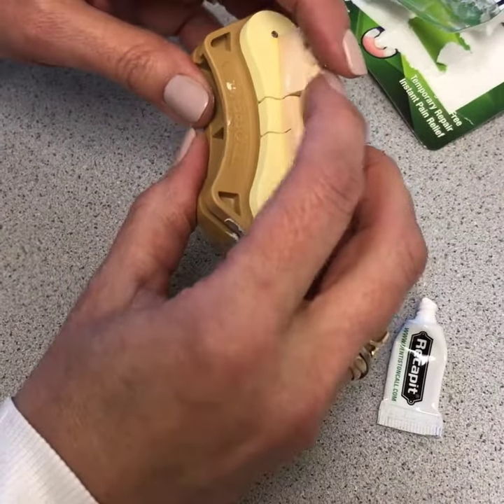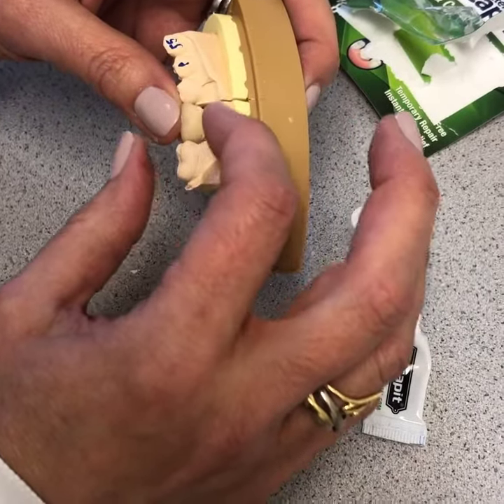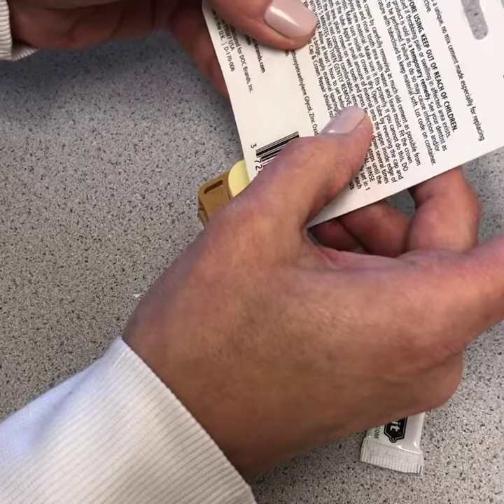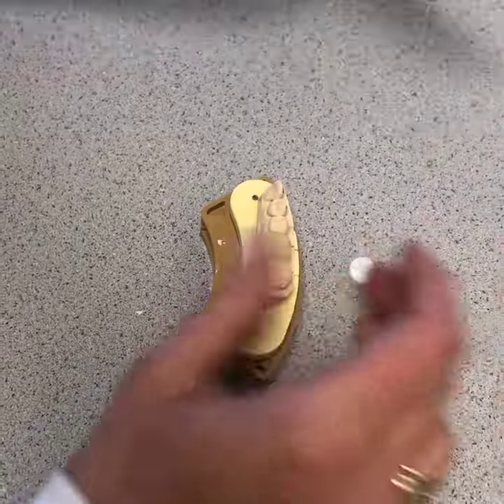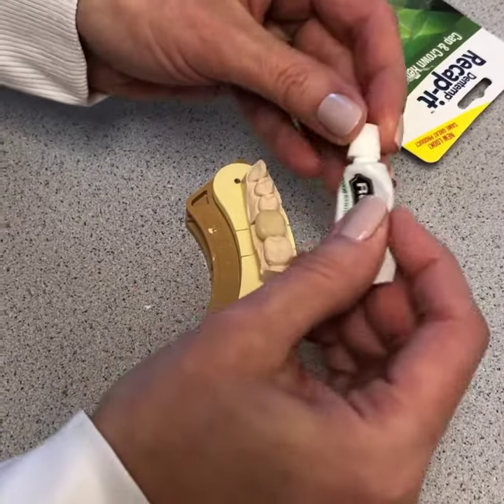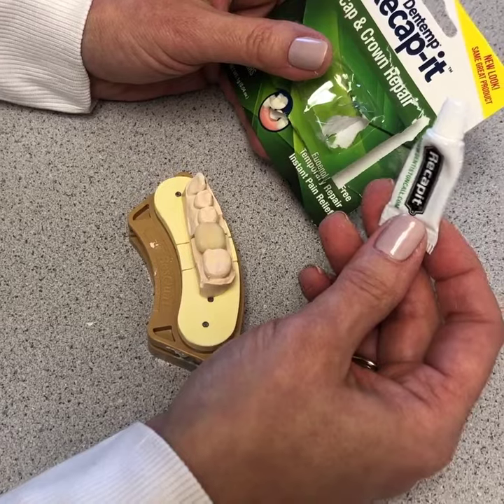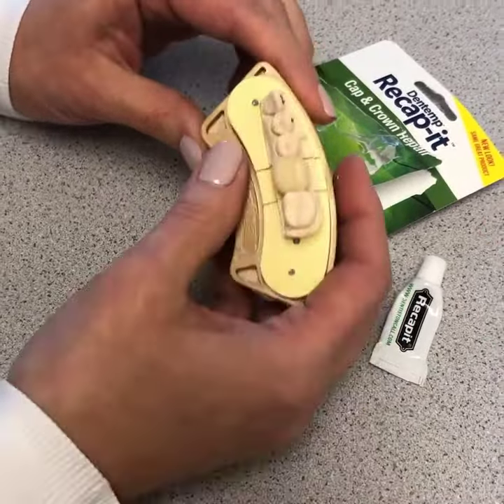Go ahead and place it on the tooth and squeeze it down. If anything comes out, just bite down on a rolled piece of paper towel. When it dries, you can take your toothbrush and brush it off. Keep biting on it — it has instructions as to how long, but it's usually two or three minutes and it should be okay. This is a handy thing to have while traveling. If you can't get to your dentist, this is a temporary way to keep loose crowns or temporaries in until you come to our office.